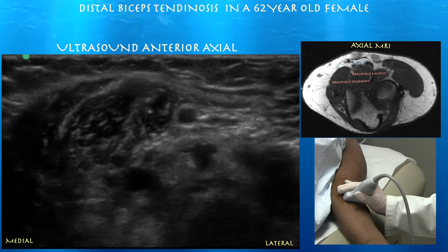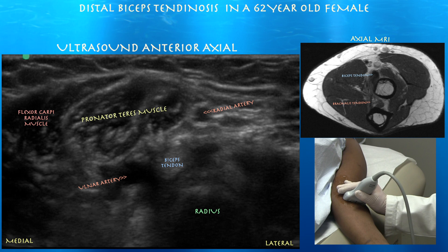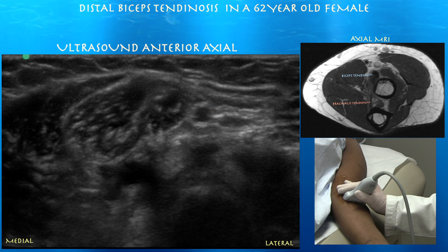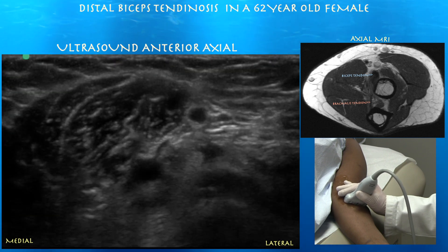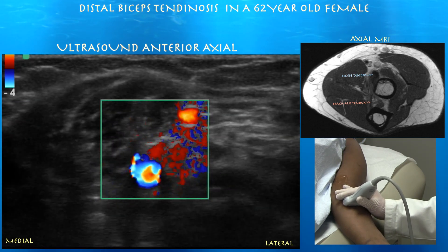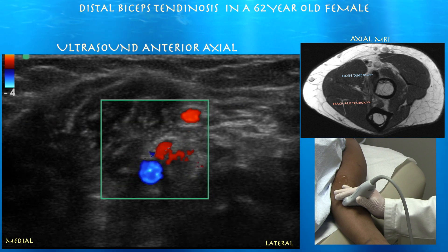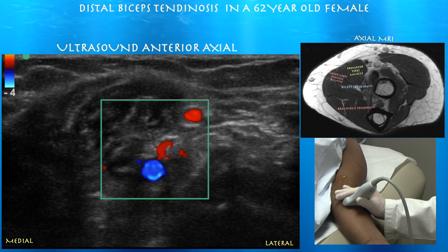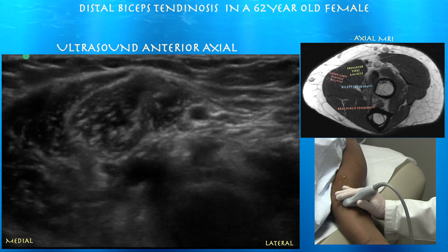Here we can see the distal biceps tendon close to its insertion on the radial tuberosity, with the ulnar artery just medial to that and the radial artery superficial to the biceps tendon. With color Doppler, you can see the ulnar artery in blue on the bottom and the radial artery in red on top, and the common interosseous artery branching off the ulnar artery. The tendon is right next to that, so you can use the vasculature as a landmark for where the tendon is.